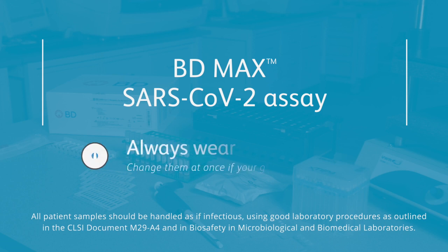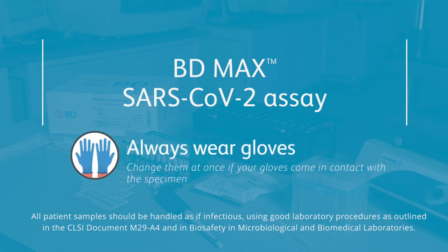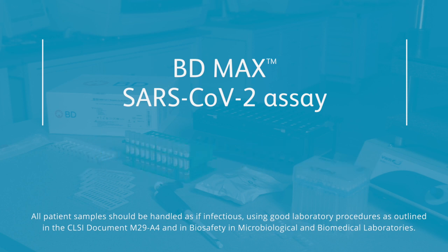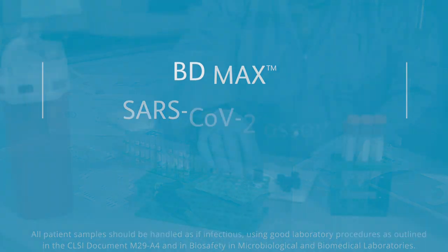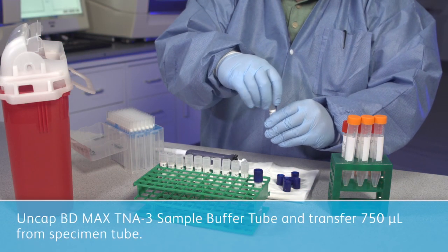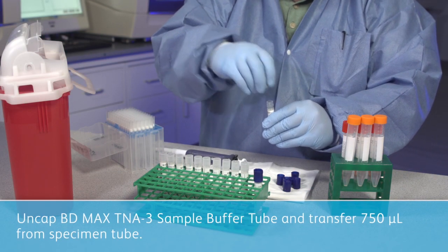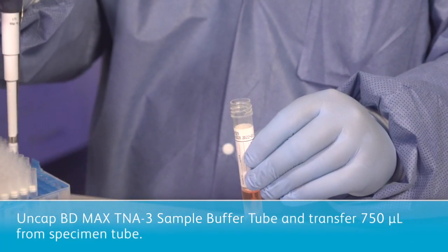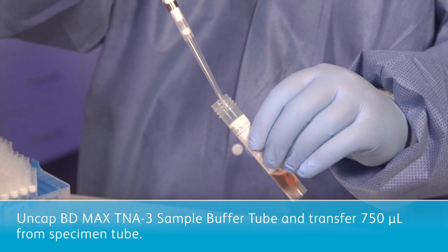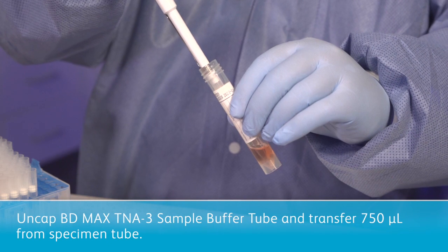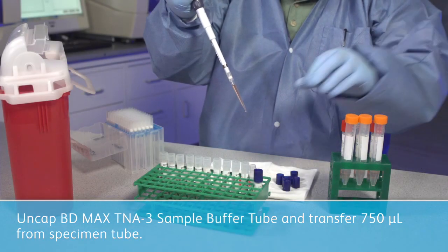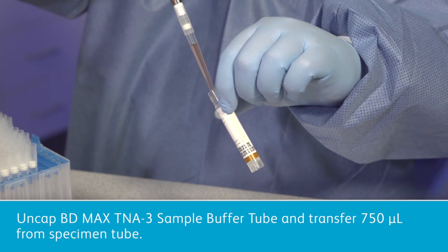As before, always wear gloves when handling specimens and change them at once if your gloves come in contact with a specimen. It's also important to allow frozen specimens to reach room temperature before proceeding. First, uncap the BD-Max TNA-3 sample buffer tube and transfer using a calibrated variable pipette 750 microliters from the UVT or UTM or saline specimen directly into the BD-Max TNA-3 sample buffer tube.